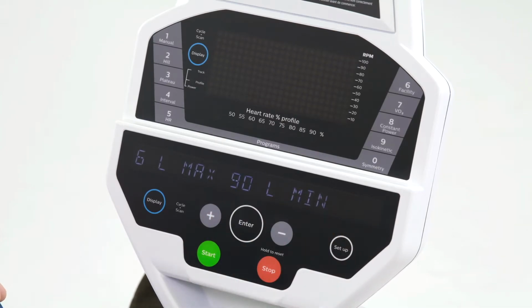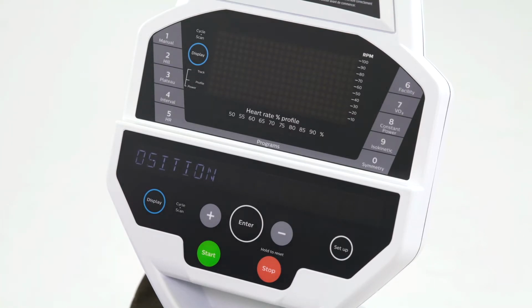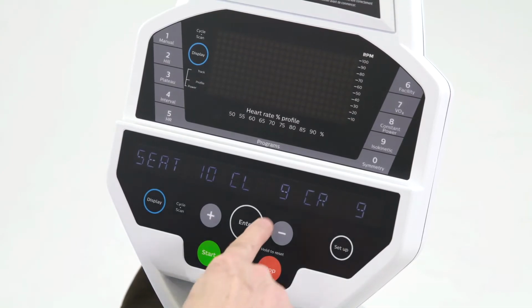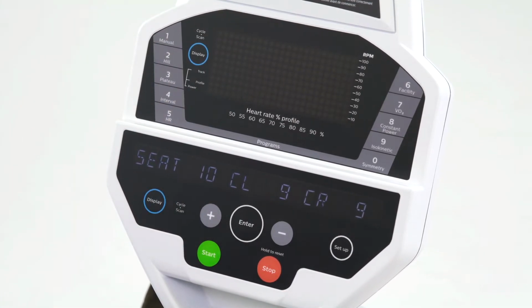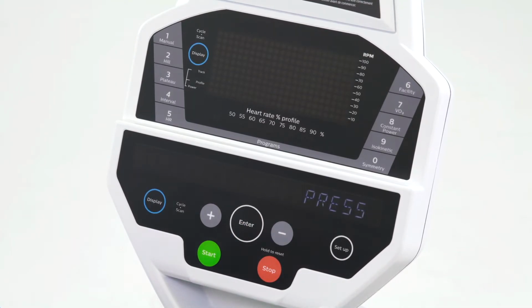So this patient has a functional range of 80 degrees, and what we're able to do now is calculate what this patient's seat position should be based on the height we entered, and what the crank position should be based on the patient's range of motion. So the seat should be set at 10, and then the left crank would be set to 9, right crank set to 9. So you go down and set the crank to position 9, and that will allow the patient to go through 90 degrees to 10 degrees. 90 degrees here, 10 degrees here.